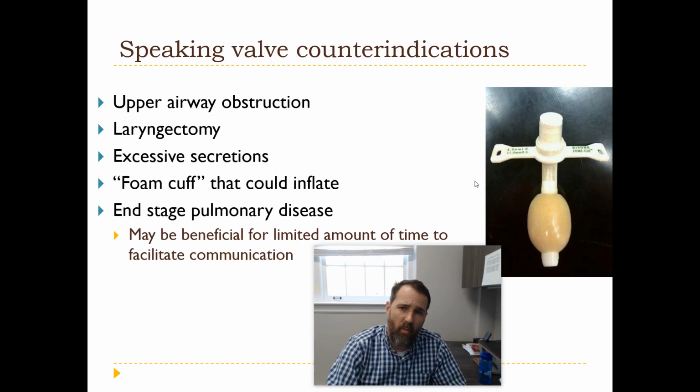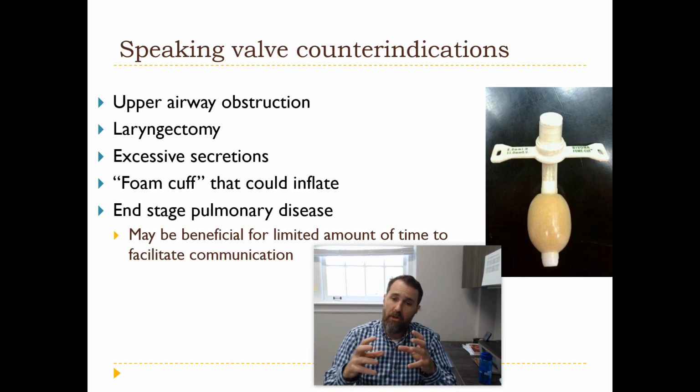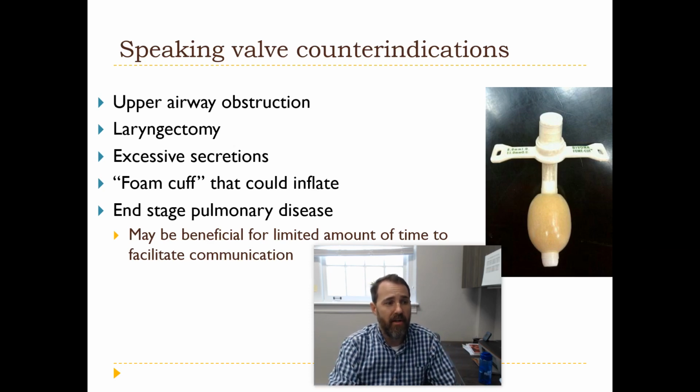You also want to be wary of foam cuffs. And so looking at this tracheostomy tube, that is a foam cuff. The foam cuffs are larger than the air cuffs, which allow them to create an effective seal within the trachea with less pressure on the trachea because of their greater surface area.